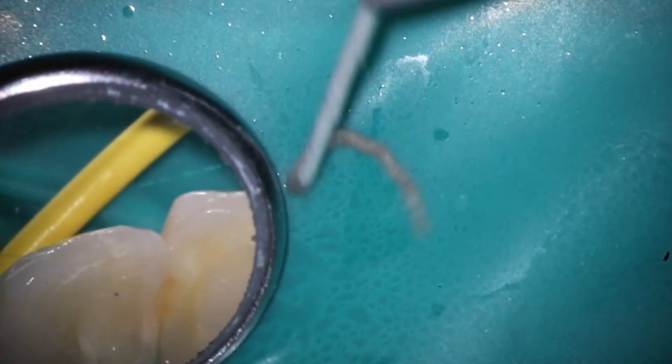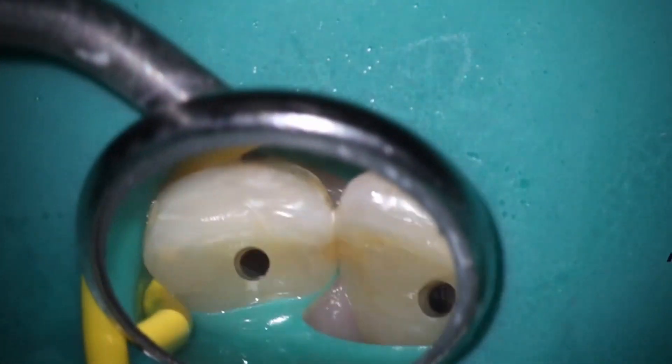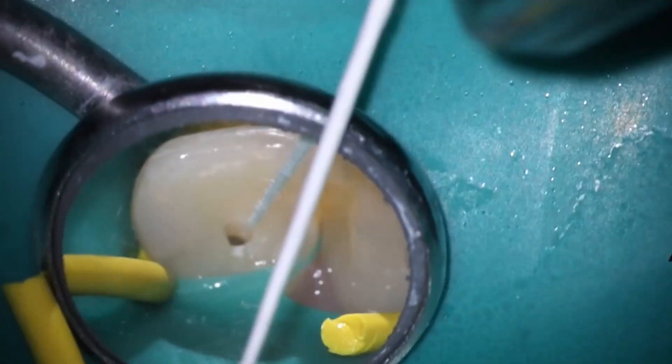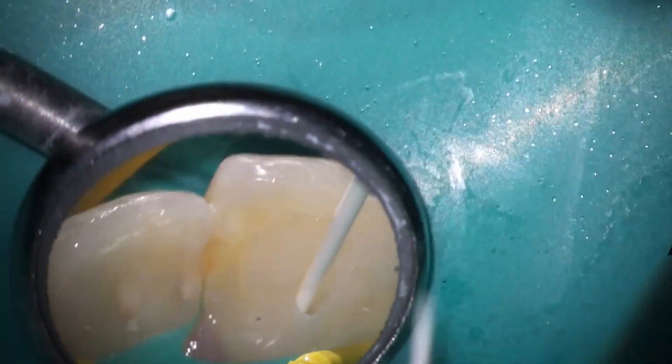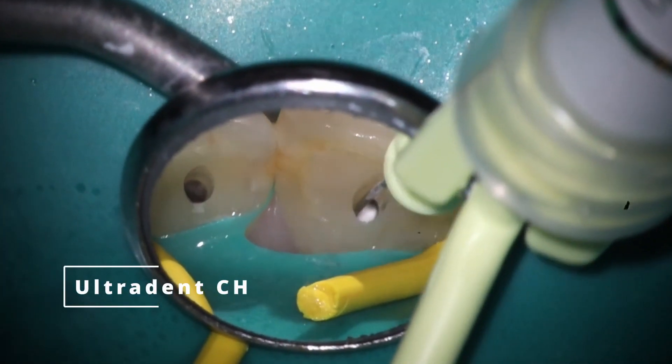That right there is usually a sign of Prevotella denticans, which is really common in retreats. You definitely want to use calcium hydroxide if you see that — that's what I call grody pus nasty cans. And that's the test here. You can see how that paper point collapses when you put it on there. This is a good test to see if you are completely dry. If you are completely dry, you should be able to push against the rubber dam and the paper point is not going to collapse anymore. At this point, I've decided it's nasty enough — let's go ahead and use our calcium hydroxide.